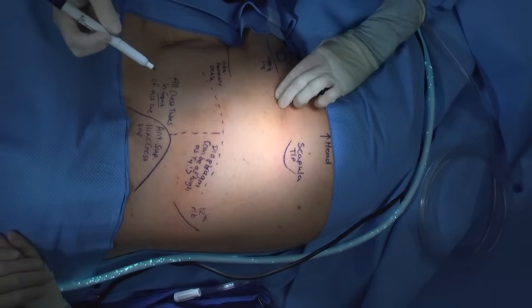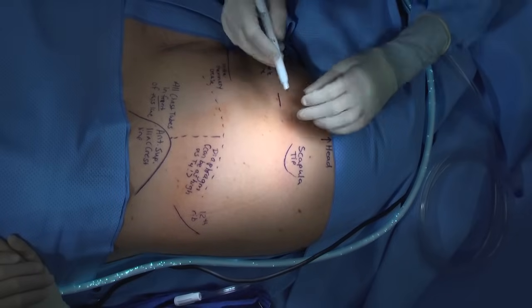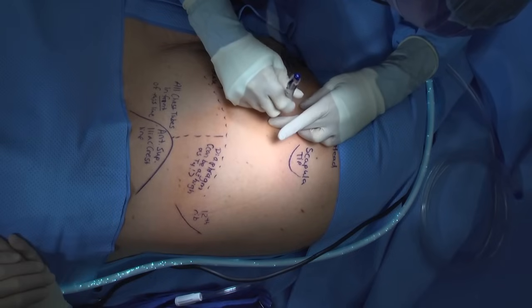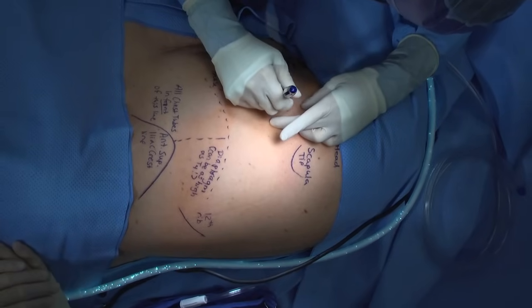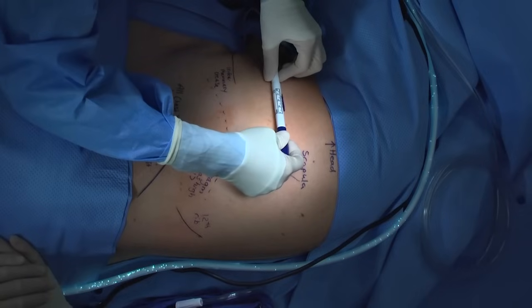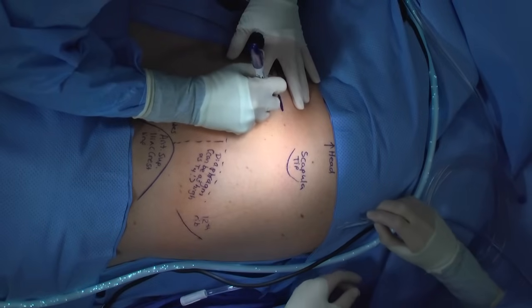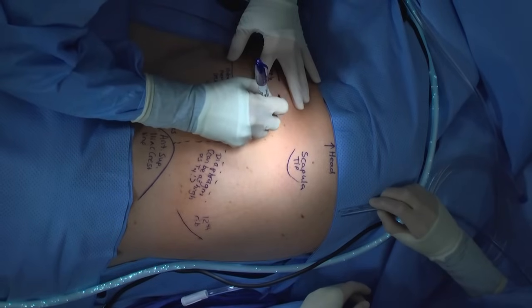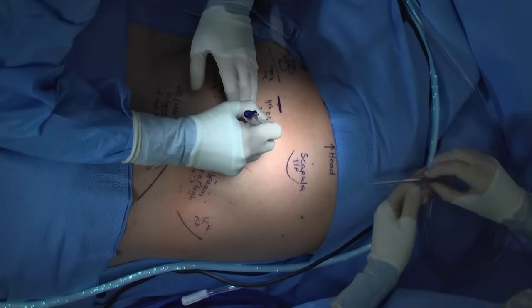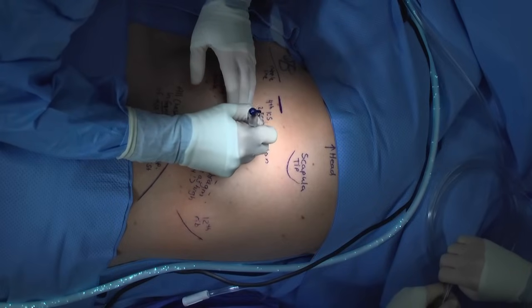Lateral to the nipple is a safe place in most patients for chest tube insertion. Before even beginning to prep or drape your patient, plan your incision. It can be very helpful to use a marking pen to mark out your incision before you even begin, to make sure you have a firm idea of where you want to place your tube. When draping, always keep your landmarks in view so that you can plan your incision accordingly.